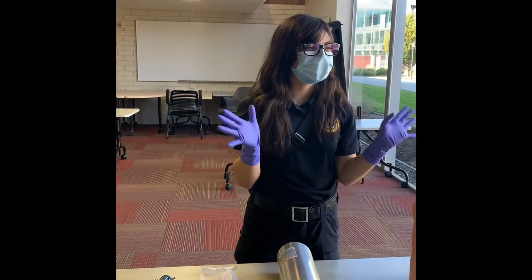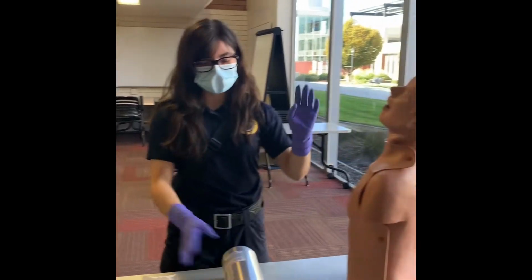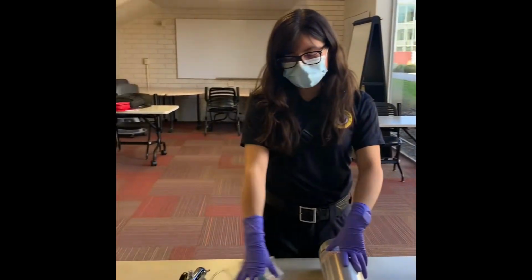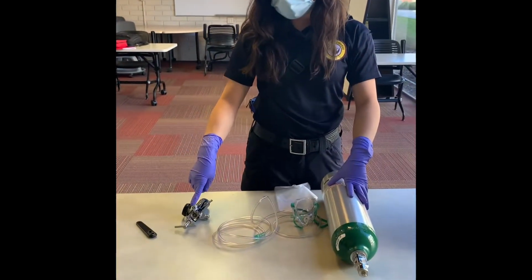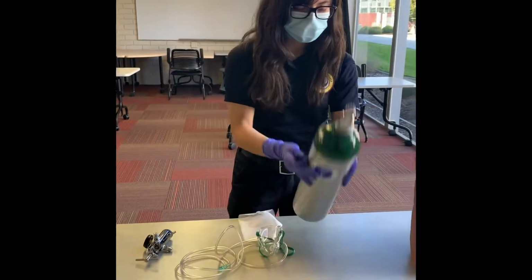I have proper PPE. I have my equipment for a patient who is having difficulty breathing. So I have my oxygen tank, non-rebreather mask with tubing, my regulator, and a wrench to open my oxygen tank.